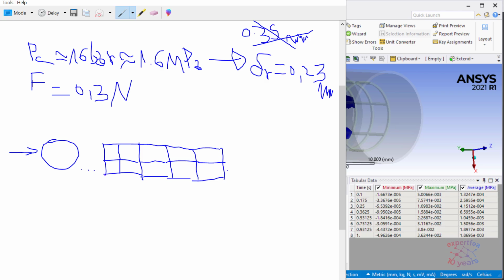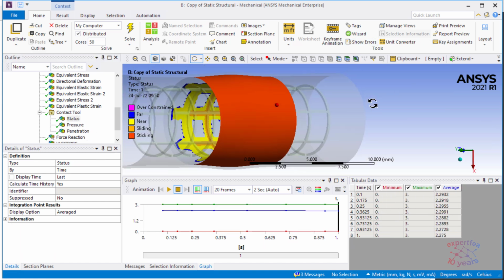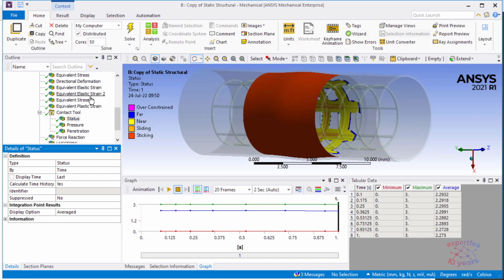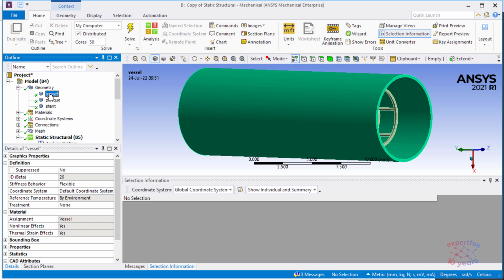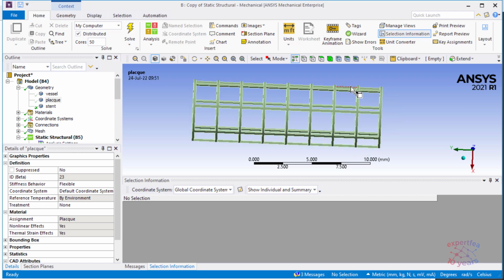Let's say, give or take, what is in contact is only such a portion, yeah, and in the entire stent, we have, let's see if we can, let's hide the vessel and the plaque. So we have, this is an instance of real contact, and we have 1, 2, 3, 4, 5, 6, 7, 8, 9. Let's say 9 instances, even though we're missing here and here. I will say 8.5, yes.